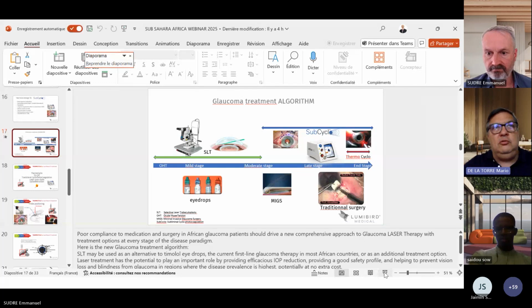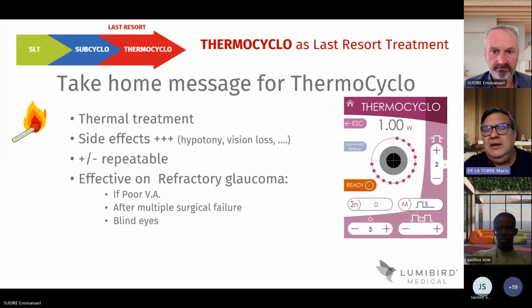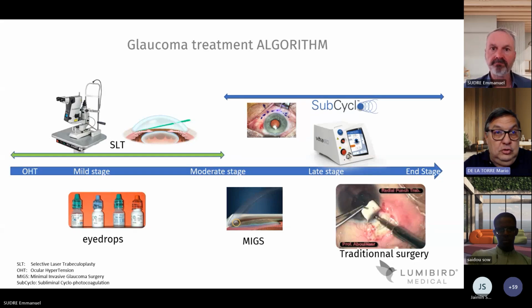What happens when you receive a patient that has an unsuccessful post-glaucoma filtration surgery? Can you add? Remember, you have an area that you can't treat, but you have another area where you can make the treatment. What is the rationale of the treatment?